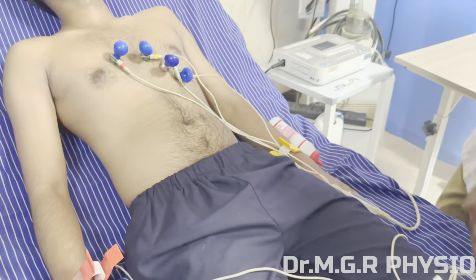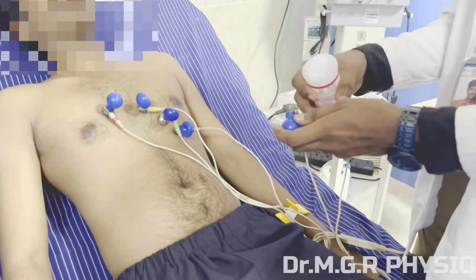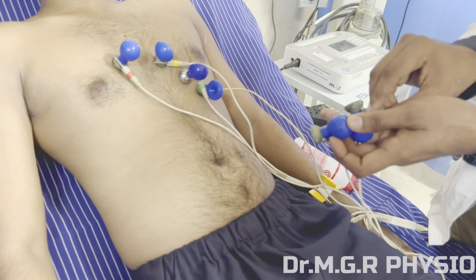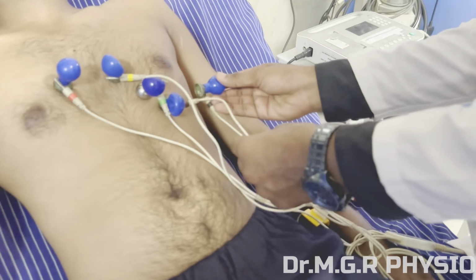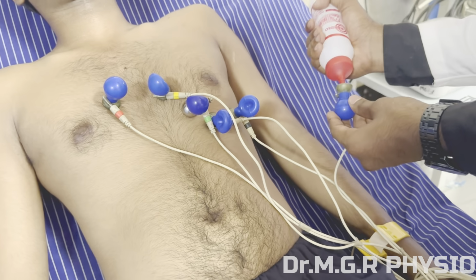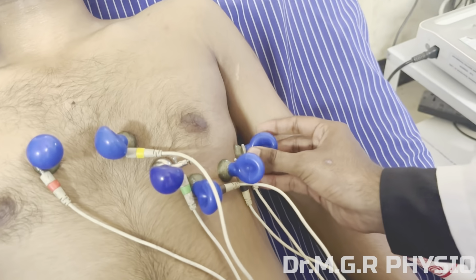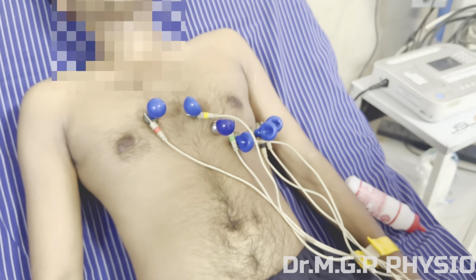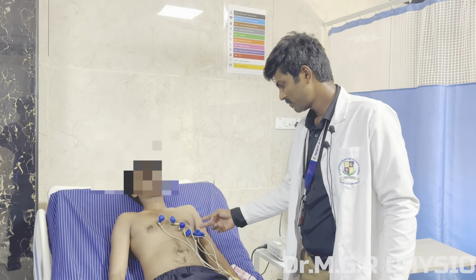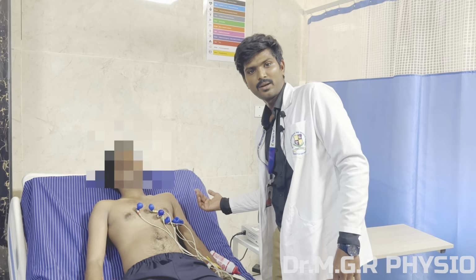After this, you go for V5 and V6. The position of V5 is in the anterior axillary line in the 5th ICS, and the position of V6 is in the mid-axillary line in the 5th ICS. So this is the placement of the chest leads. Basically, V1 and V2 focus on the interventricular septum, V3 and V4 focus on the anterior left ventricular wall, and V5 and V6 focus on the lateral left ventricular wall.